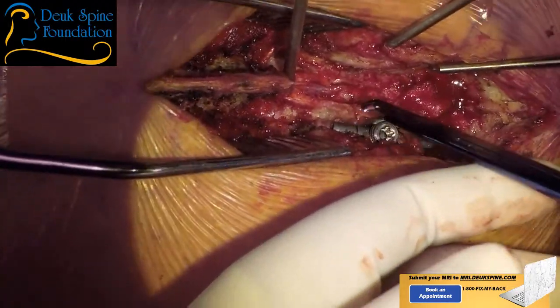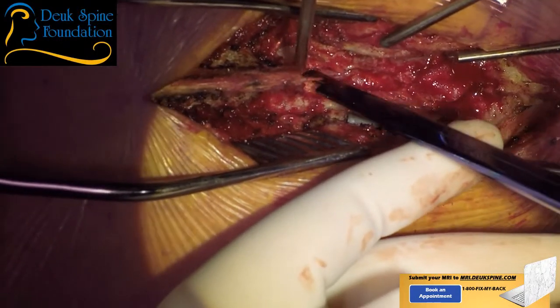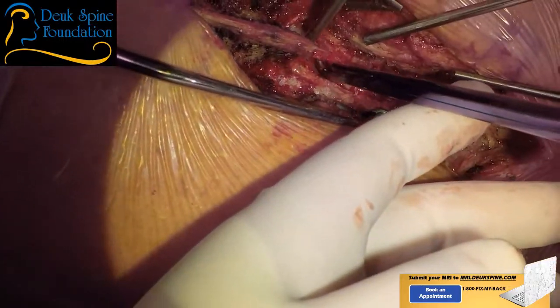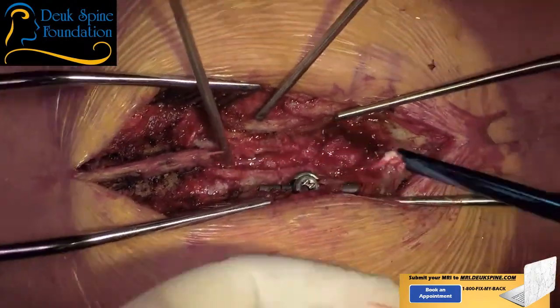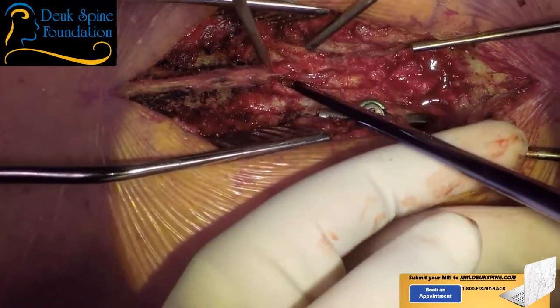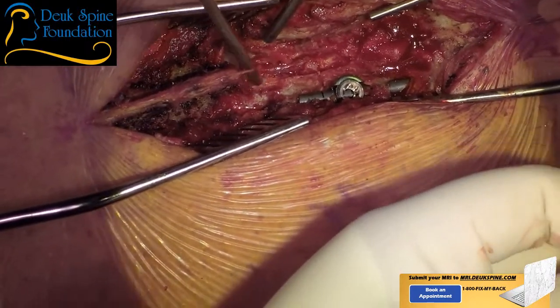It's called a double crush. We call it a double crush. And it just means it was crushing the spinal cord from the front and the back. So you've got a disc herniation and bone spurs in the front, and you've got this ligament right here, thick and buckling, pushing on the spinal cord in the back. Oh yeah, and that ligament is also inflamed, and that causes the redness you're seeing on the spinal cord.